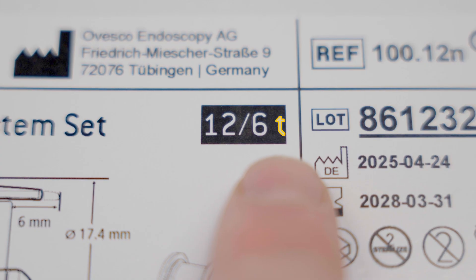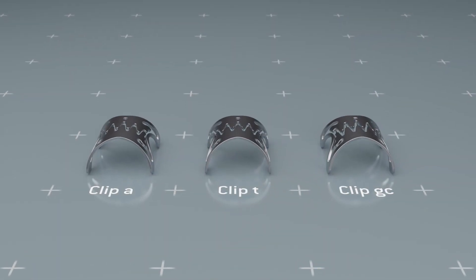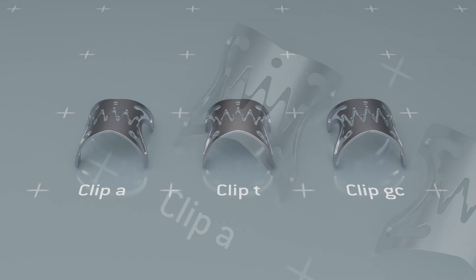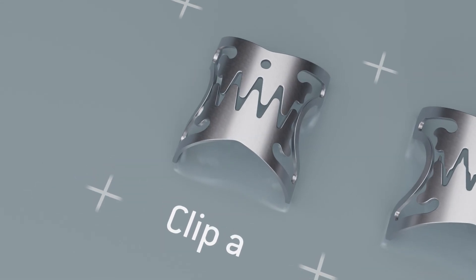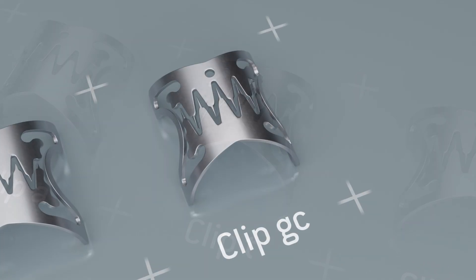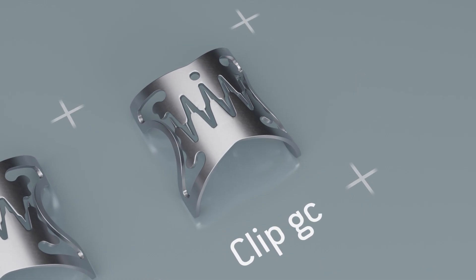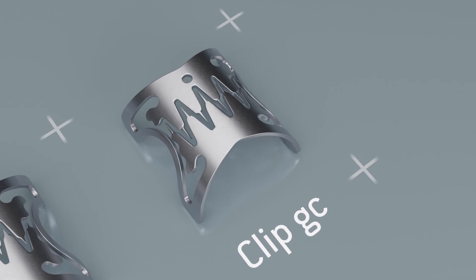The latter stands for the clip-tooth geometry. There are three different versions of the OTSC NEO clip: Type A with blunt teeth, type T with pointed teeth, and type GC with longer pointed teeth, specifically for the treatment of perforations and lesions in the stomach.